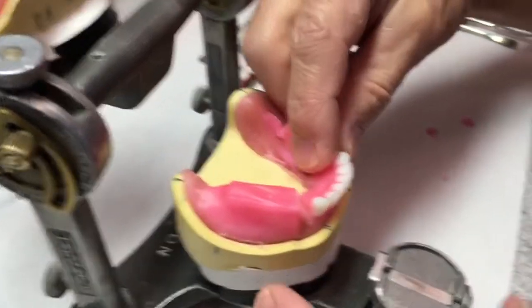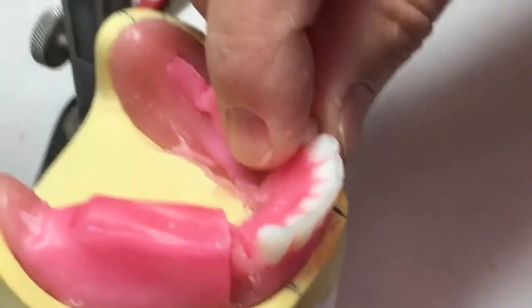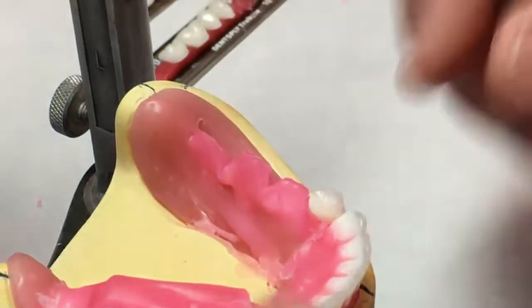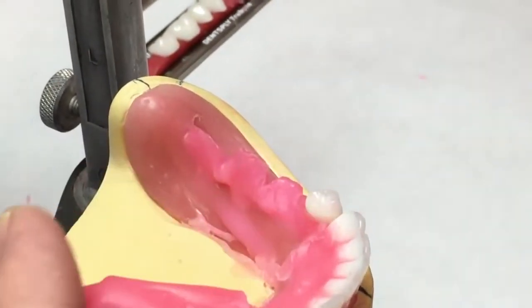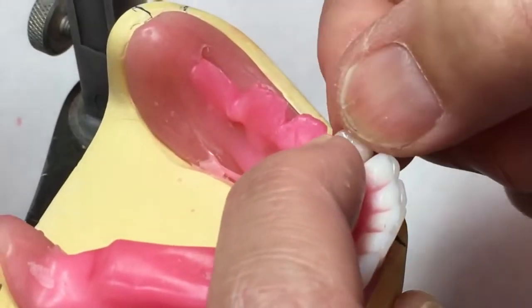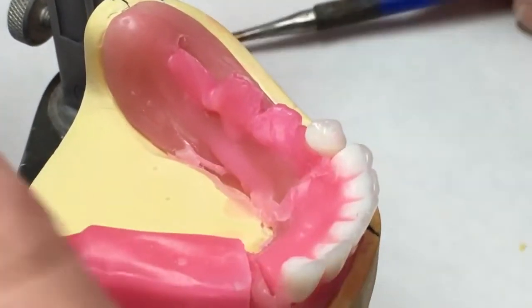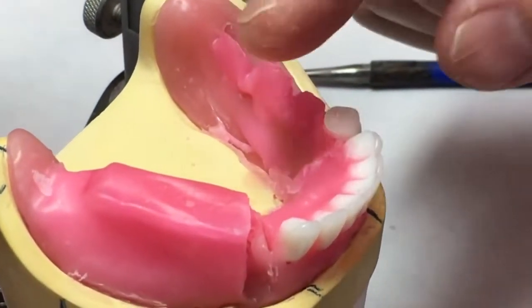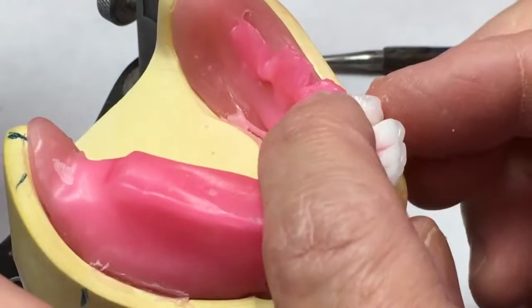I'm going to set the first premolar, keeping in mind that the proximal contact is not in the middle of the tooth — it's out on the buccal half of the tooth. We're lining the cusp ridge of the canine up with the flat zero-degree where the cusp would be on this tooth. That keeps the mandibular premolar lingual, not out on the buccal.